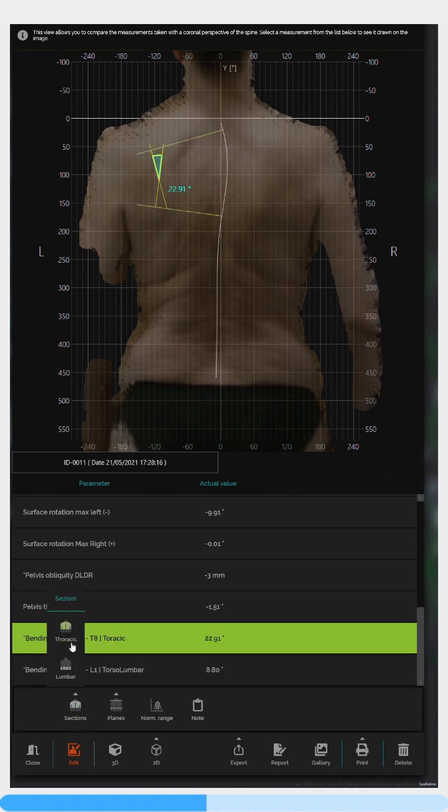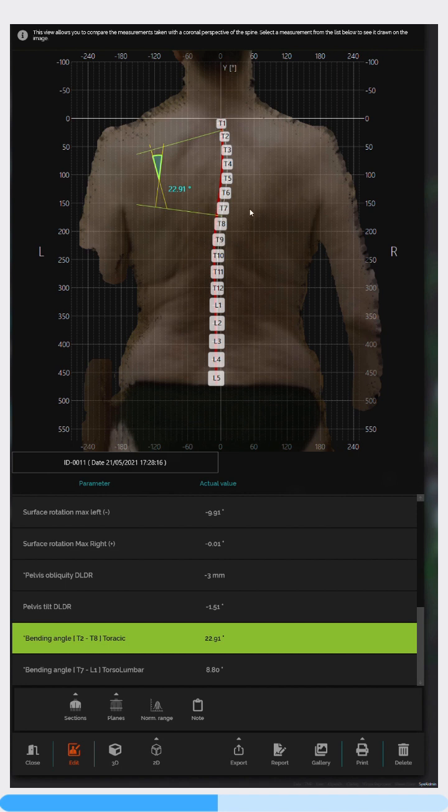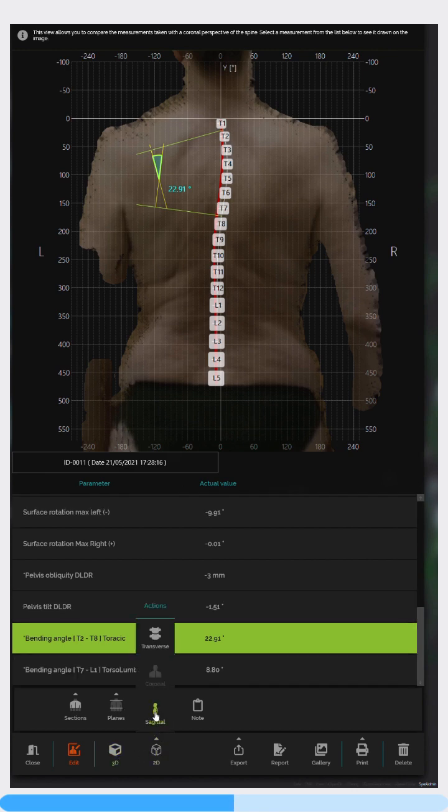There's also potential for mild scoliosis in this area, which the machine is picking up at 22, 23 degrees. So there's a shift, and that will correlate with the shoulder, where she gets all of her pain. And so there's a mild shift and rotation, two components required for scoliosis.